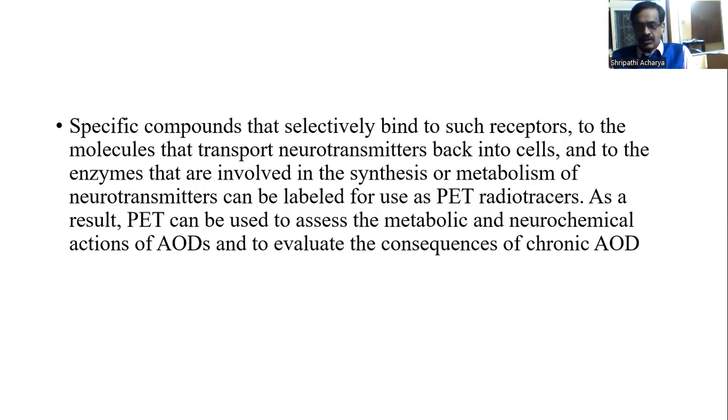So, as a result, PET can be used to assess the metabolic and neurochemical actions of AODs and to evaluate the consequences of chronic AOD use.